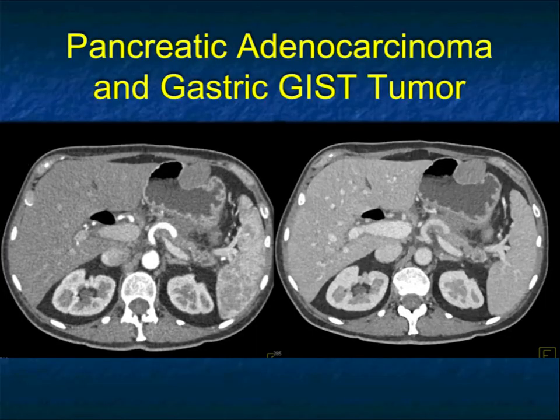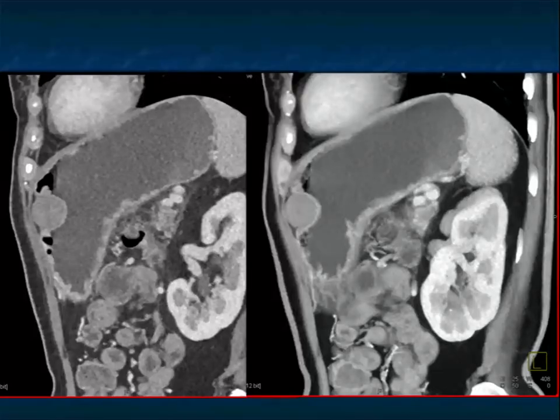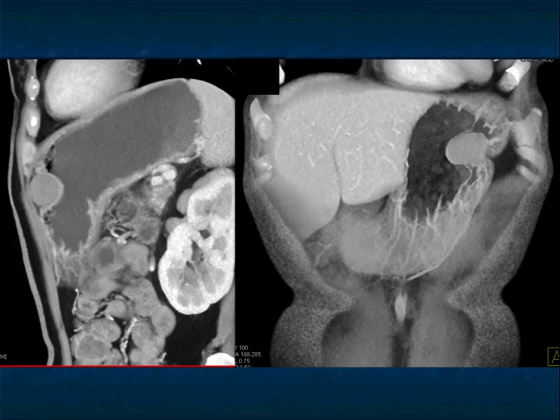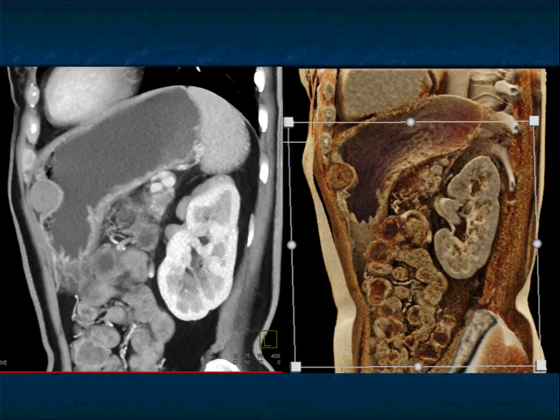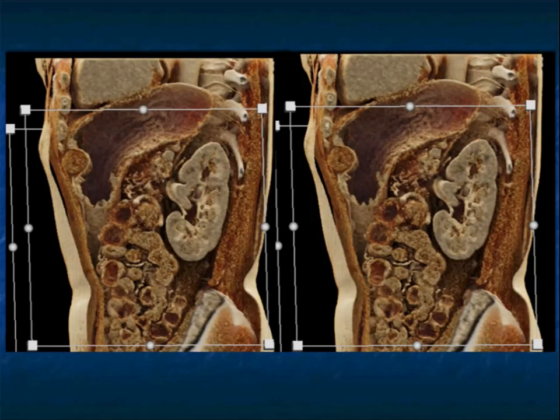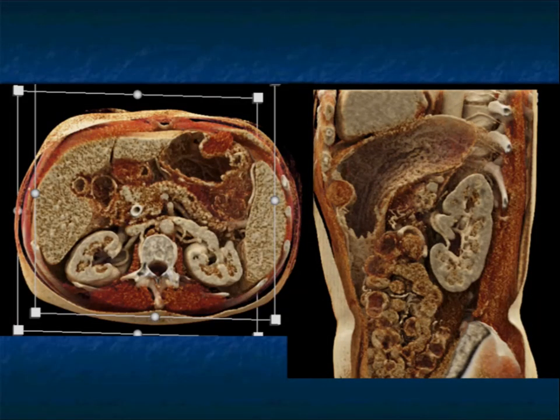Here's a patient with pancreatic cancer who also has an incidental gastric mass that is mostly exophytic with an intraluminal component, nicely submucosal. Cinematic rendering and classic volume rendering nicely show the lesion. With good gastric distension with water on cinematic rendering, you get a nice look at the gastric folds. You can adjust windowing and centering on cinematic to get the best look of these tumors. Whether a tumor is intraluminal or extraluminal alone does not determine malignancy; size is the critical factor.